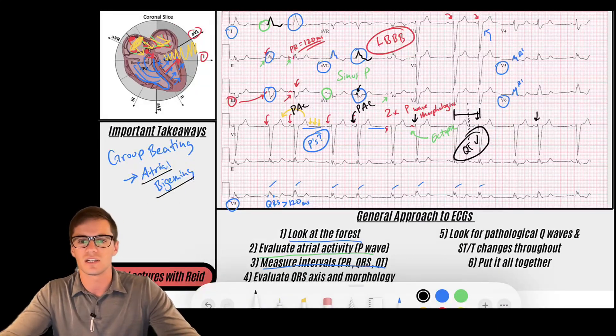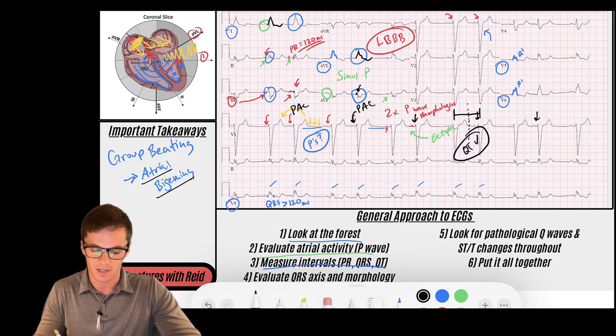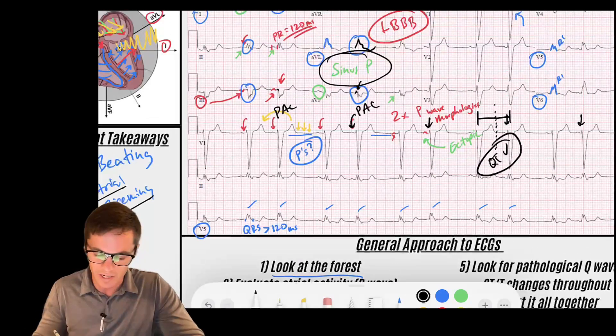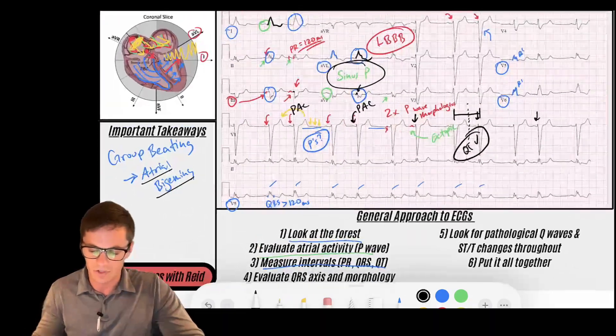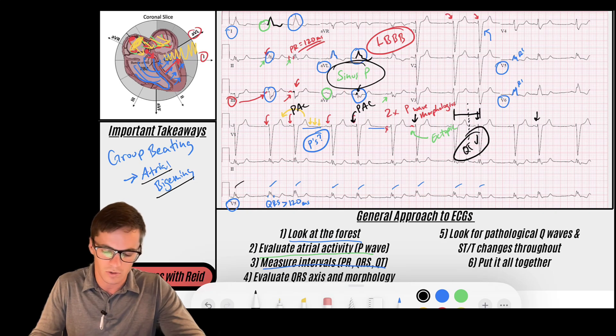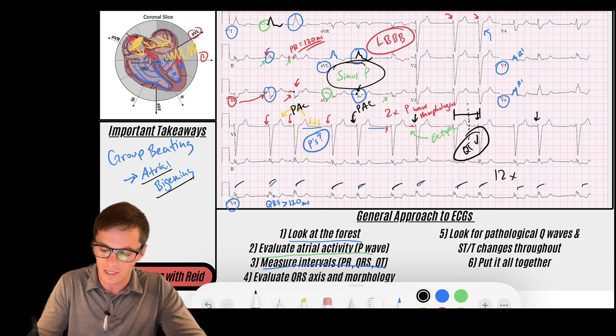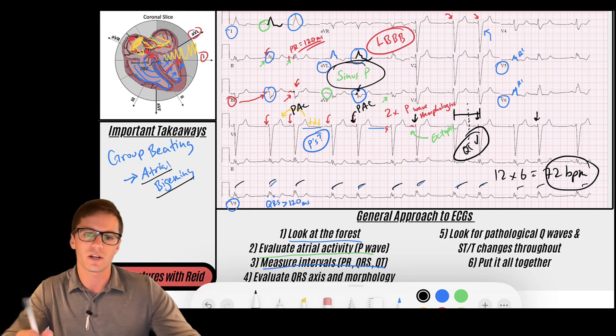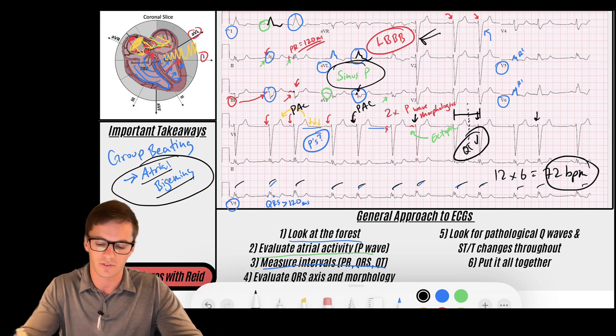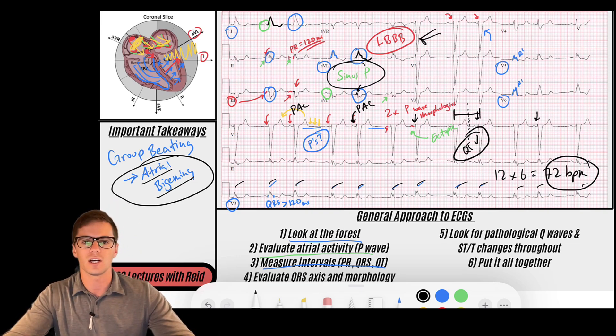Let's put this all together and what do we get? We get a sinus rhythm. I guess I didn't even do the rate, let's do the rate. Our rate here is, sometimes whenever you have bigeminy every little bit's a little different. You can count all of the beats on this strip - it's a 10 second strip, multiply by six. Let's just do that for ease: one, two, three, four, five, six, seven, eight, nine, ten, eleven, twelve. So 12 times six is 72 beats per minute. I'm sure that's not exact but we're in the ballpark. So we've got a rate of 72 beats per minute, we got a sinus rhythm with atrial bigeminy and a complete left bundle branch block.